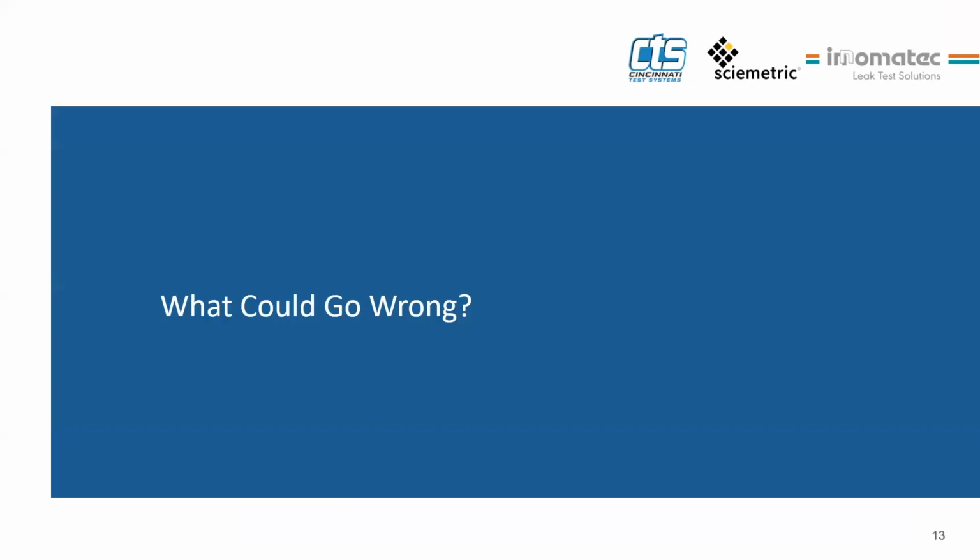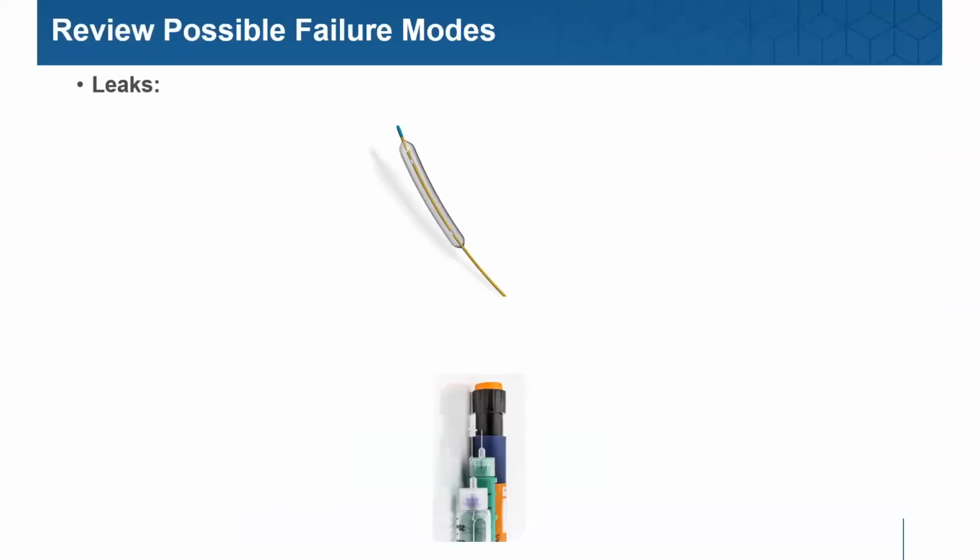So with that, let's talk about your parts. You've developed a new medical device. What could possibly go wrong? Well, leaks. Are there joints that may be perforated or may allow ingress or egress due to improper assembly? This is something you'd know as PFMEA or FMEA or FMA.